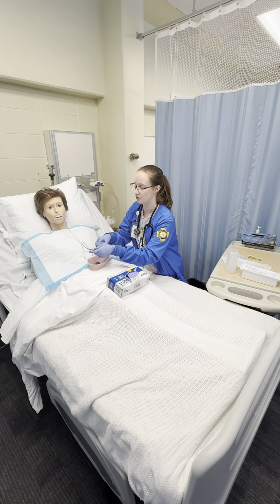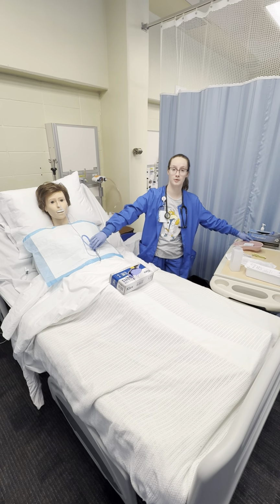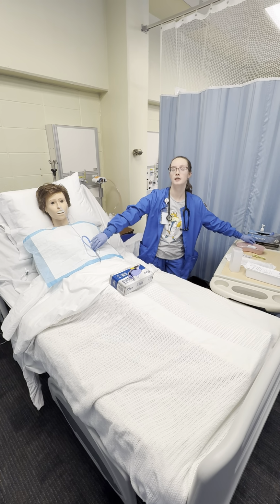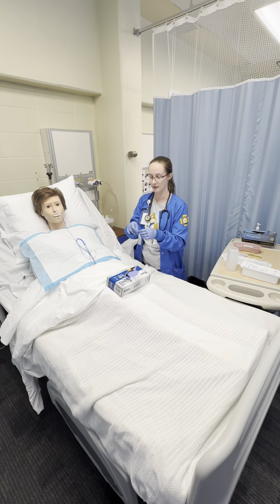So now I'm going to confirm the placement of the tube even more with an X-ray. So for the sake of the video, the patient's gone down for an X-ray and has returned, and the X-ray has confirmed the proper placement. So now that the placement has been confirmed by X-ray, we are good to secure the tube a little bit more permanently.